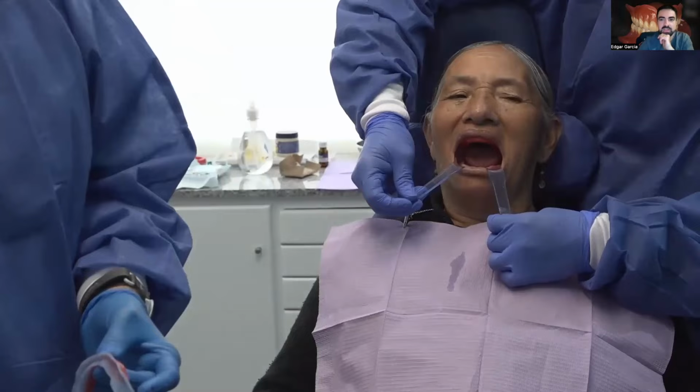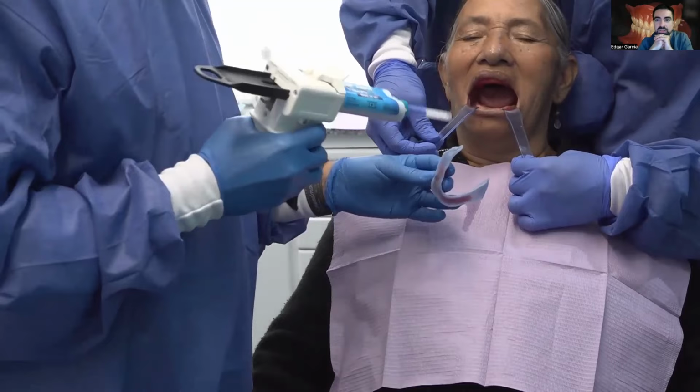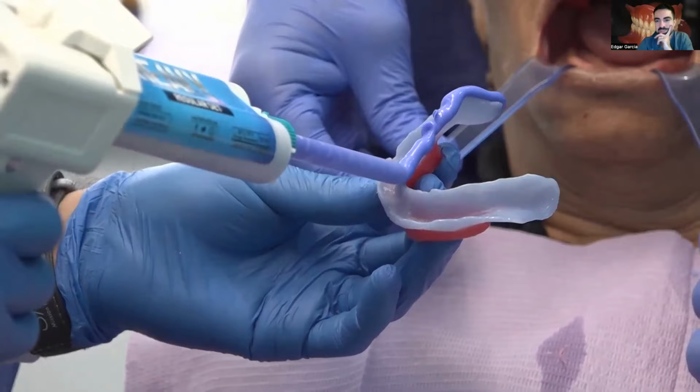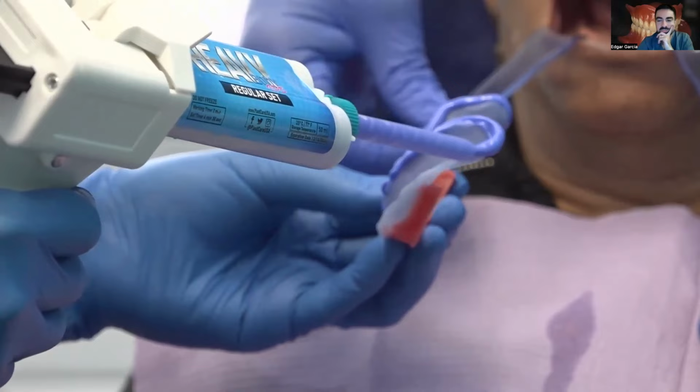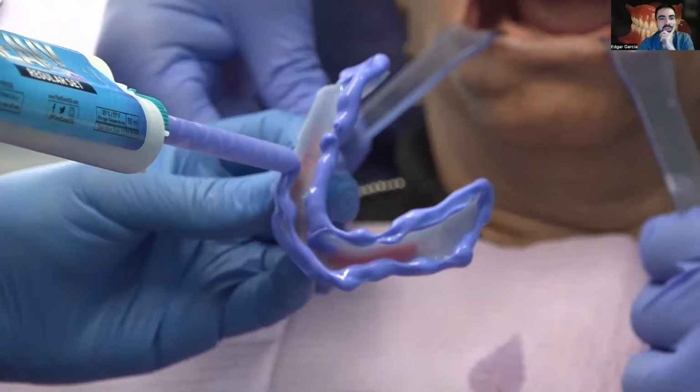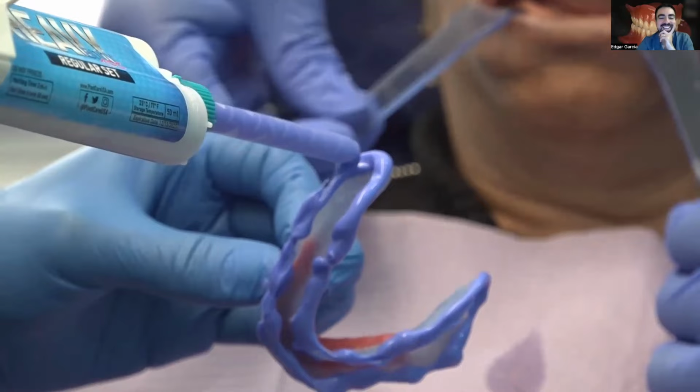here's the video. The retractors. The upper is only border molded, right? Exactly. Because if it's not border molded, it'll move. In some cases, it will fail. And you've border molded and you also already eliminated the excess of the border molding. Exactly. And then you put it back in the patient's mouth. Correct. And also you can put Vaseline on the upper one, because you don't want them to be glued, to stick together, right? Exactly.